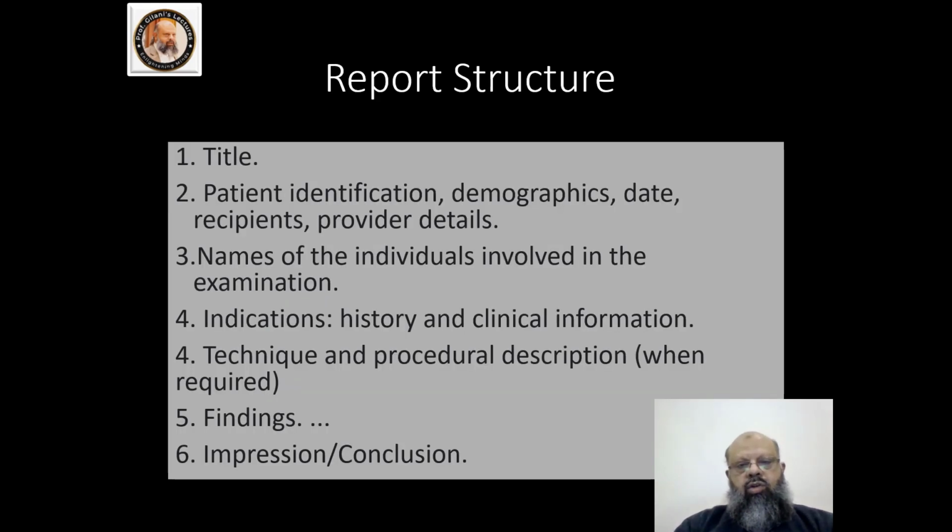The main structure of the report consists of the title, the patient identification, demographics, date, recipient or referral, and the provider details, the name of the individual involved in the examination, the indication like the history and clinical information if provided, then the technique and procedural description when and where required, then we mention the findings and give the conclusion or impression.